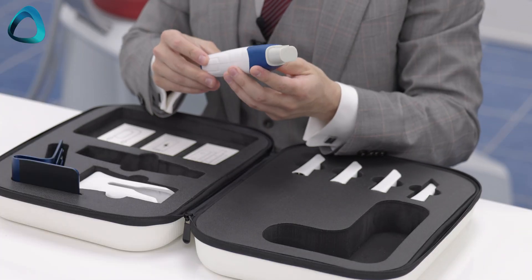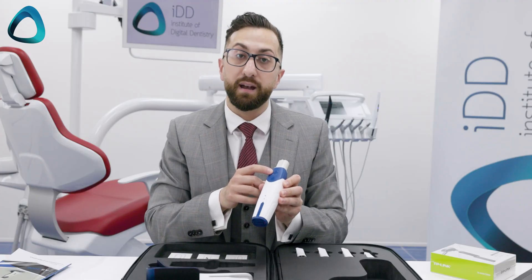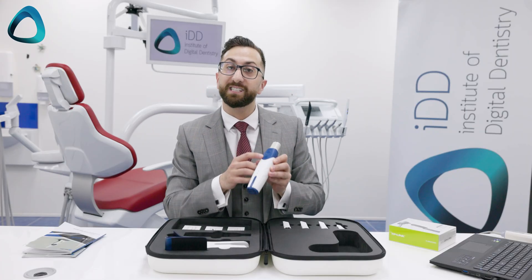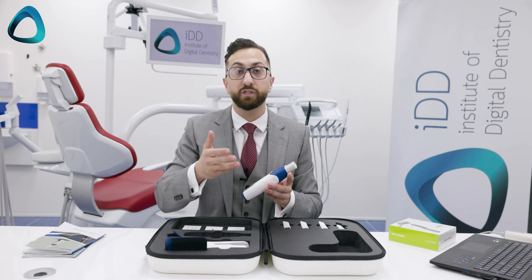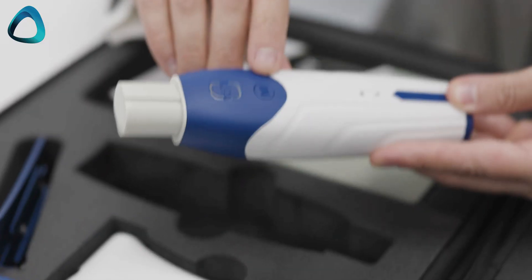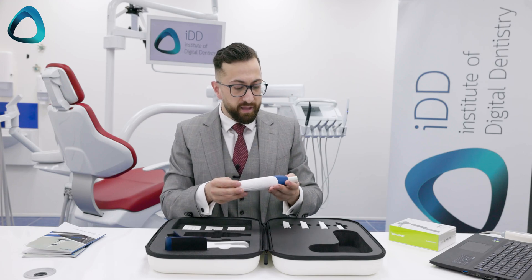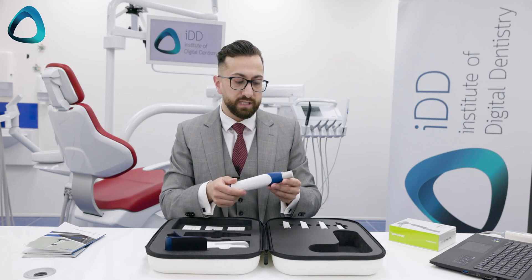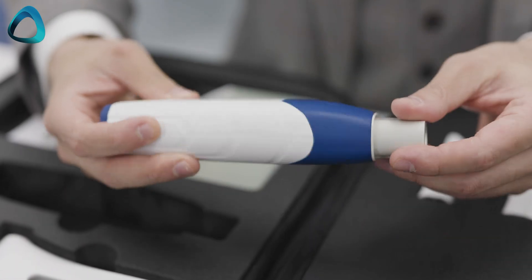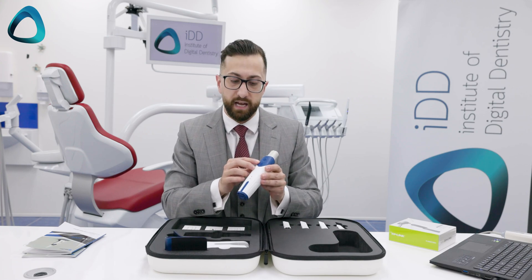Looking at the scanner a bit more, we can see it has two buttons. This is the scanning button at the top, and you have this mode button with an M on it. This mode button is to shift through the workflow in the scanning software — for example, if you're scanning the upper arch, you press the mode button and it will take you to the lower arch and then to the bite. Just like the previous generation scanner, we also have scanning buttons on both sides, which is a really cool feature, meaning regardless of which way you're holding the scanner, you're always in reach to start scanning.